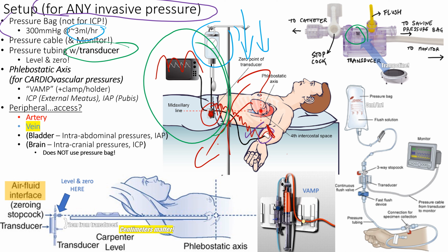So if you look inside the transducer right there, you can move this guy around. That one's attached, and there's another one coming around here. If you look at the transducer, that little black thing is a literal trampoline. You just kind of zoom in right there. That is a trampoline, and there's fluid bouncing against it. You're applying pressure forward, and whatever pulsations you get back from the patient are going to be transduced onto this trampoline right here, whatever pressure it may be.